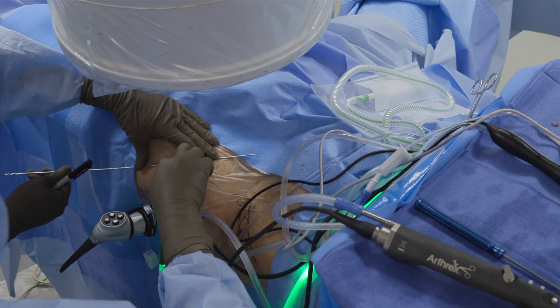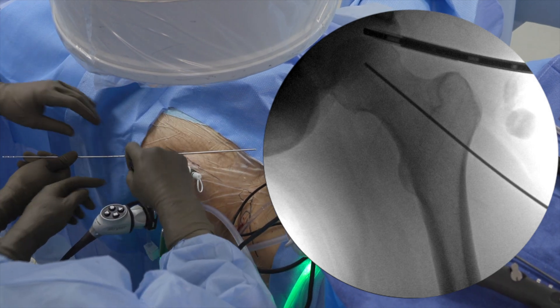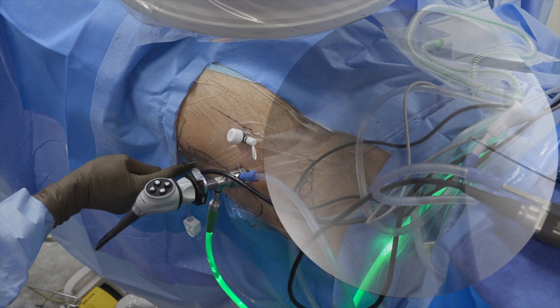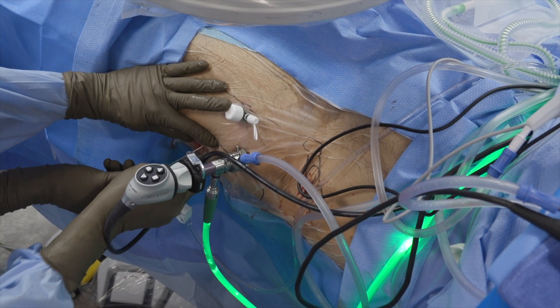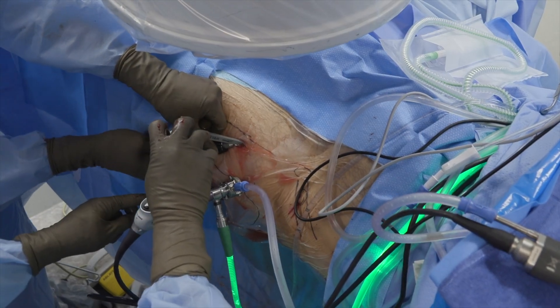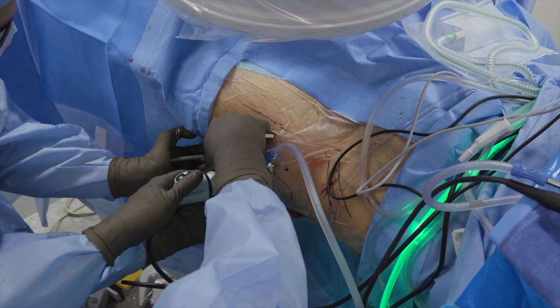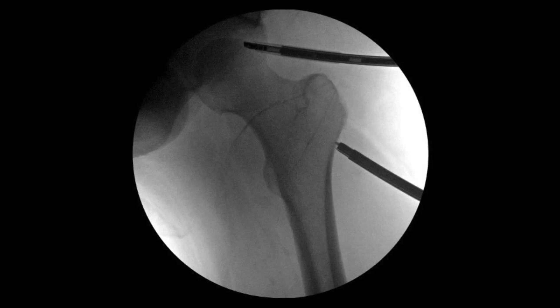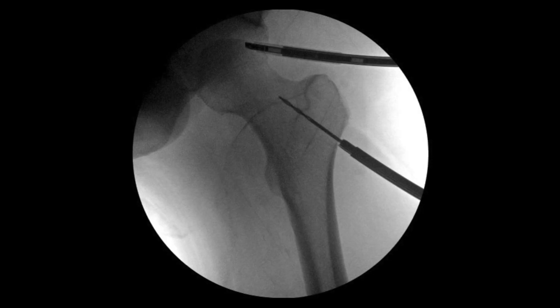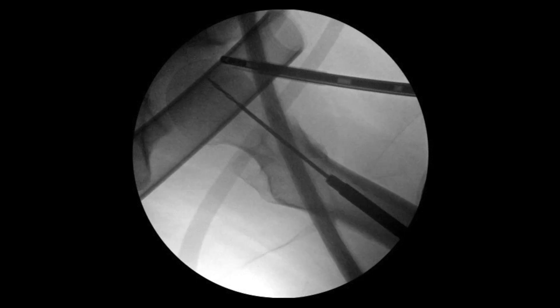Next, attention was turned to the core decompression. Under fluoroscopic guidance, a guide wire was placed externally to determine the optimal entry site and an additional incision was made. A ball-tip guide was then placed on the anterior superior femoral head and the targeting device was advanced to sit solidly on bone. Using the targeting device, a guide pin was inserted through the lateral femur and advanced into the femoral head into the AVN lesion to subchondral bone under fluoroscopy.